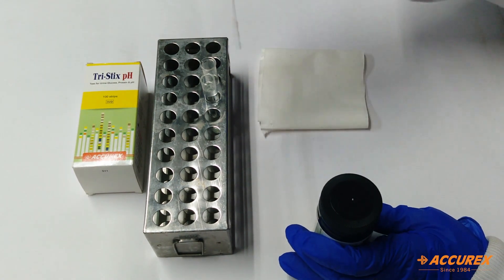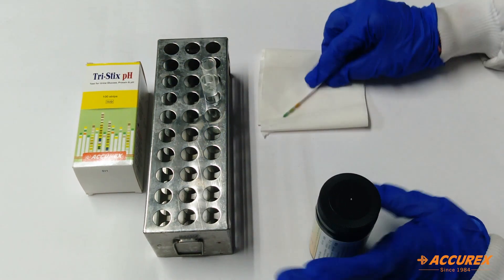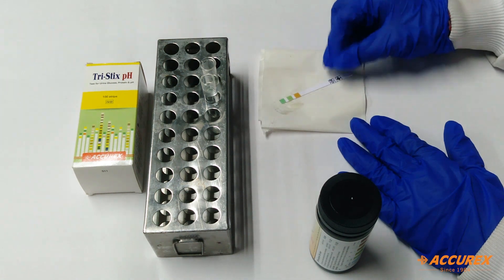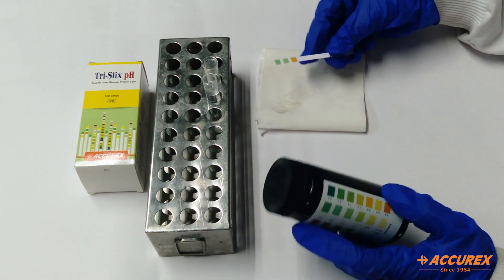Now take a strip and dip into the sample, then tap to remove excess sample and wait for 30 seconds for glucose and protein. You can check pH directly.